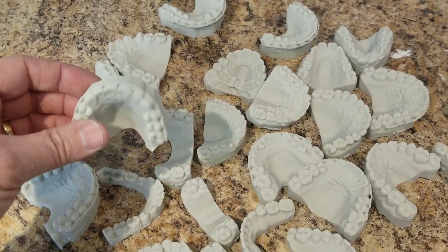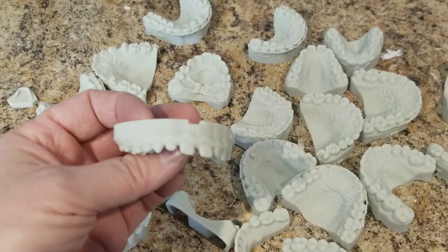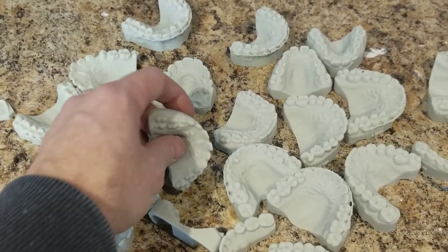All these models were printed in easy ortho shape — super fast, super efficient. So now we've got to bend retainers on all these models. That's the next step.